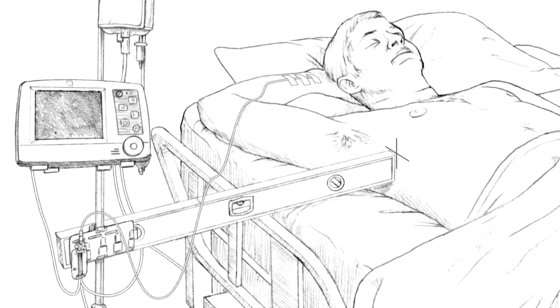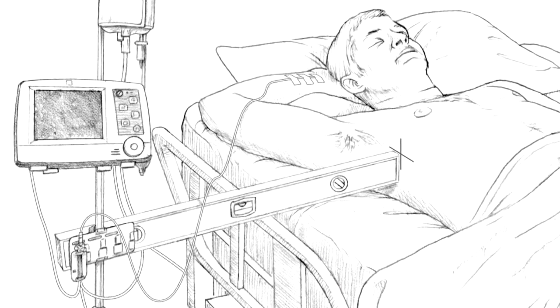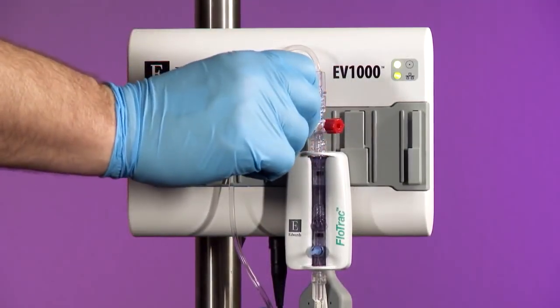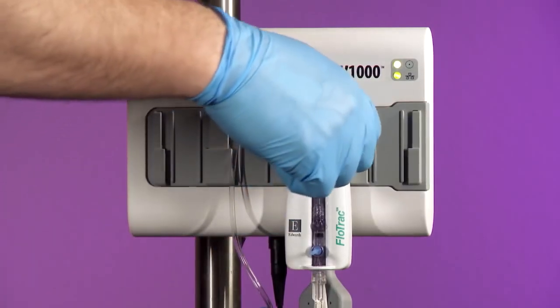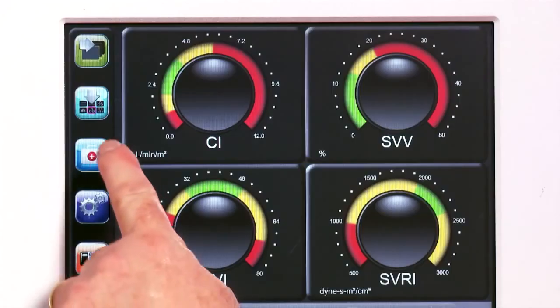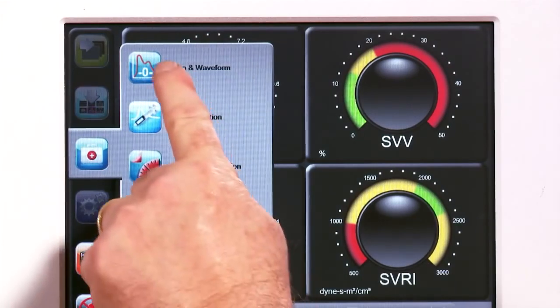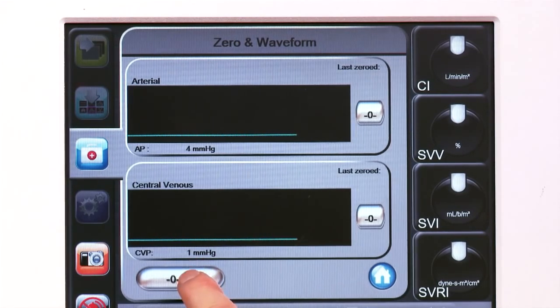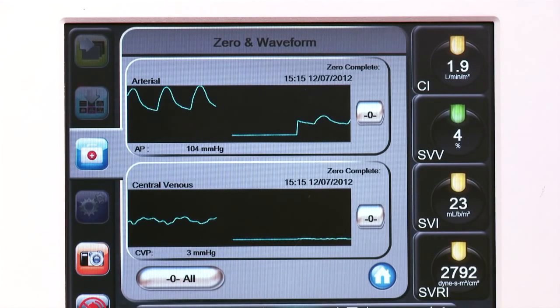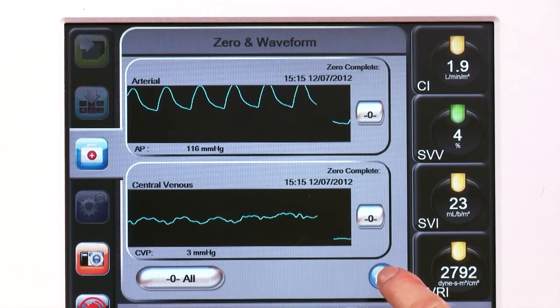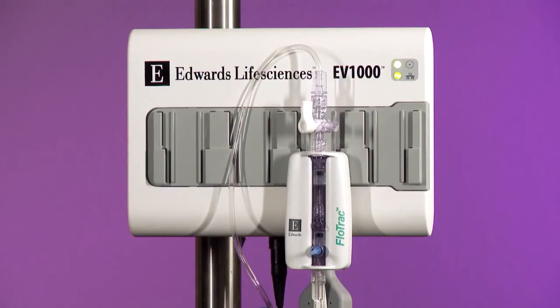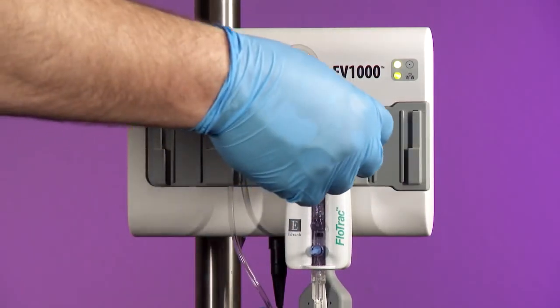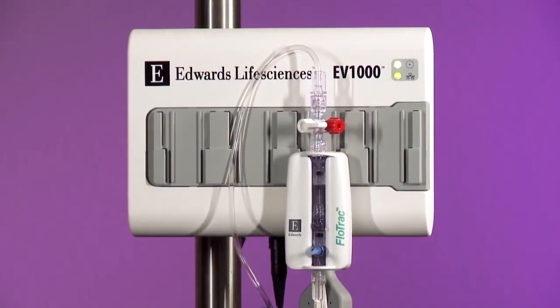Level the FlowTrack sensor to the patient's phlebostatic axis using a carpenter's level or laser leveler. Turn the reference stopcock of the FlowTrack sensor toward the pressure tubing and remove the non-vented cap. With the stopcock open to atmosphere, zero both the bedside monitor and the EV1000 Clinical Platform. Confirm that the EV1000 reads zero complete and the monitor reads zero millimeters mercury on the arterial channel. Turn the stopcock toward the reference port and replace the non-vented cap. If a patient monitor is connected, confirm the presence of the arterial waveform.